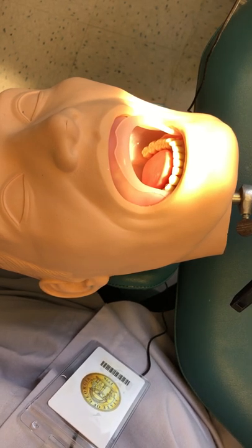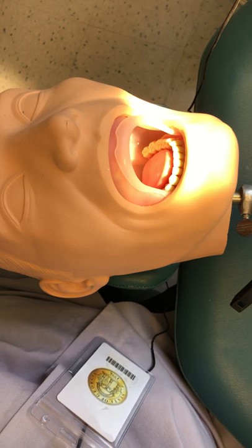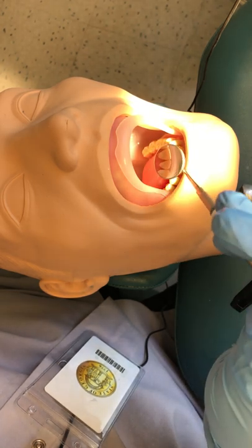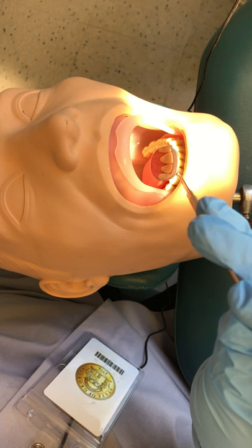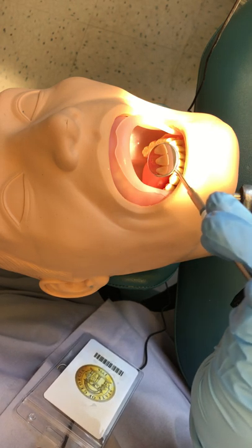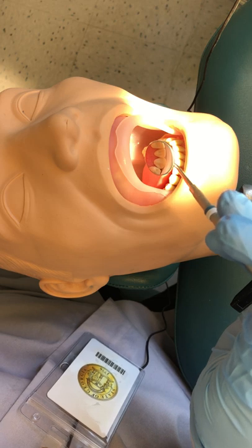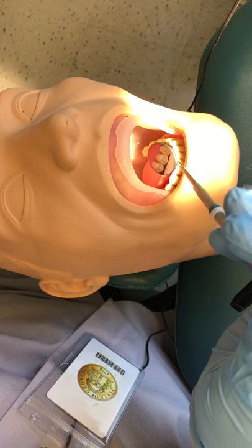This video is going to show you how to use the intraoral mouth mirror for several purposes. In dentistry, we can use a mouth mirror to retract and protect soft tissues such as the tongue, lips, or cheeks. We can use it for indirect vision, so we'll look at the teeth in the reflection of the mirror, and we can use the mirror for illumination to light up dark areas of the oral cavity.